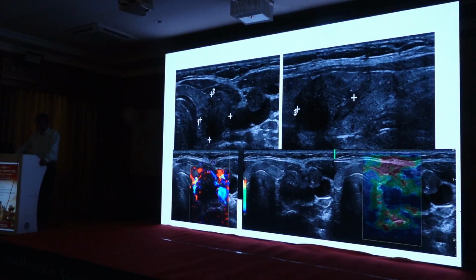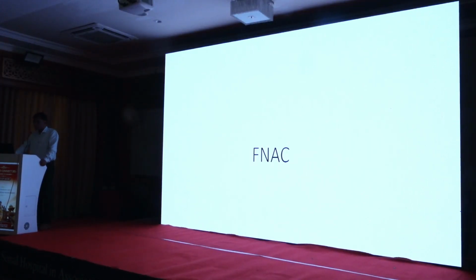Again, it is a hypoechoic nodule with very infiltrative margins, vascular, and hard on the scale. This is the scale, this is the soft indicator, and this is the hard indicator. It is among the hardest nodules, and we have to biopsy from that particular area.